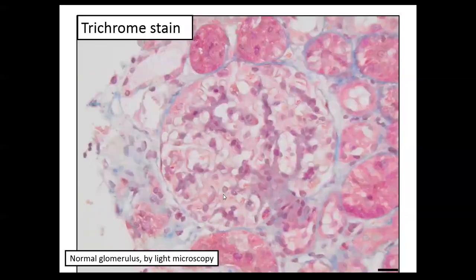The trichrome stain. Again, I have trichrome being the mesangium. I have these guys in here, which I know are mesangial cells, and I have the capillary loop here, which is pale blue, the right color. All of this material here is podocyte cytoplasm. This red flocculent material is podocyte cytoplasm. I mean, this is a gorgeous glomerulus. I can see the vascular pole. I can see the macula densa. Everything's gorgeous. Podocyte nucleus, red flocculent material, podocyte cytoplasm. I'm at a loss to say why this patient is proteinuric.